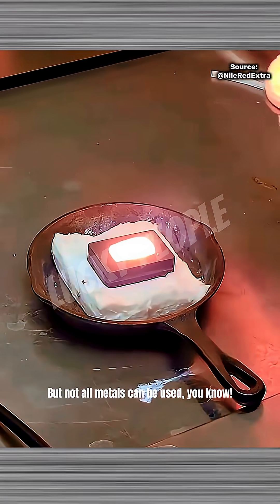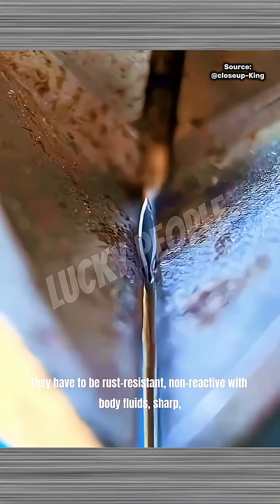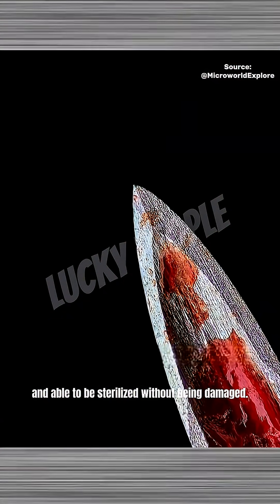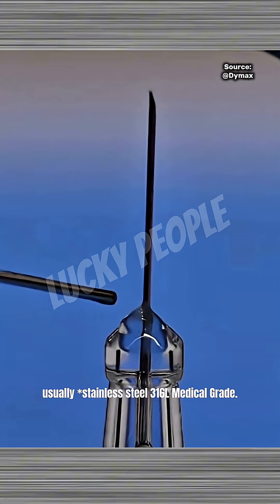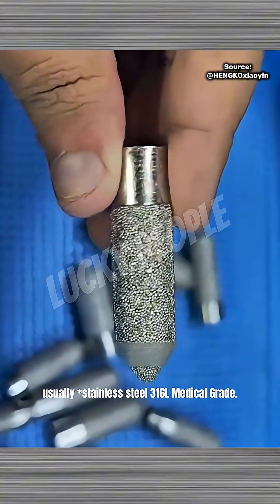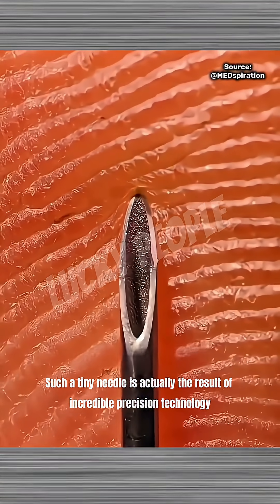But not all metals can be used, you know. They have to be rust-resistant, non-reactive with body fluids, sharp, and able to be sterilized without being damaged. That's why the material is special — usually stainless steel 316L medical grade. Pretty cool, right? Such a tiny needle is actually the result of incredible precision technology.